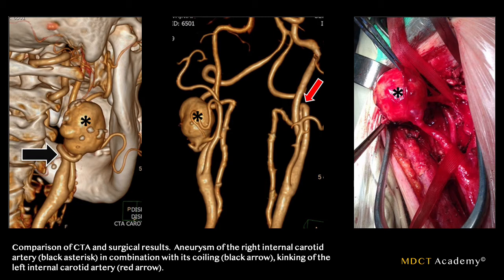Let's take a look at some cases of aneurysms in the cervicothoracic as well as the intracranial circulation. The image to your left is a 3D reconstruction demonstrating an aneurysm coming off the internal carotid artery. The middle image shows the same with bone removal, demonstrating kinking of the left internal carotid artery with more than 180-degree flexion, shown by the red arrow. The image to the right is a surgical photo of the large aneurysm.